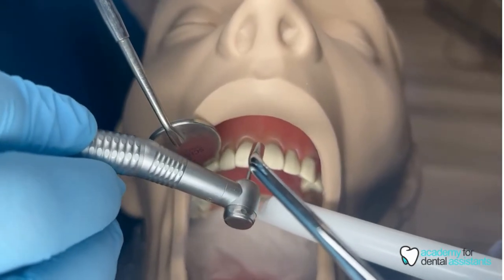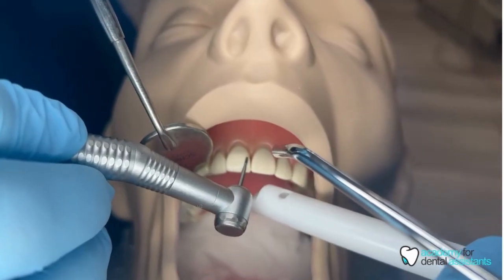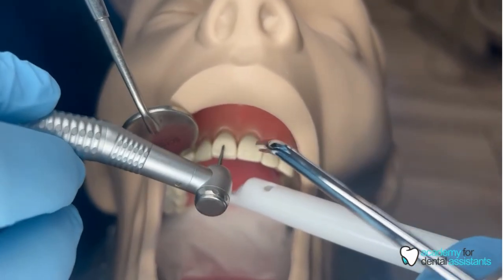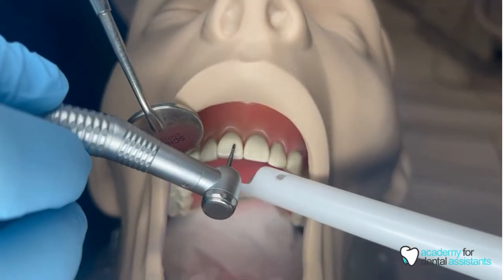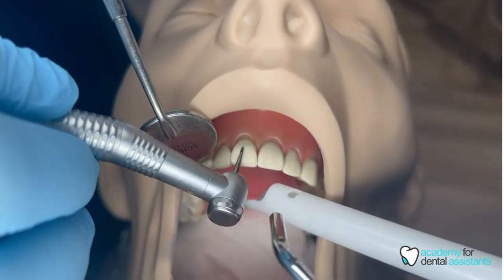Now the doctor is working on the facial side of number eight. We have the HVE placed right underneath, more towards the incisal edge and lingual side, so that we're not in the doctor's way.